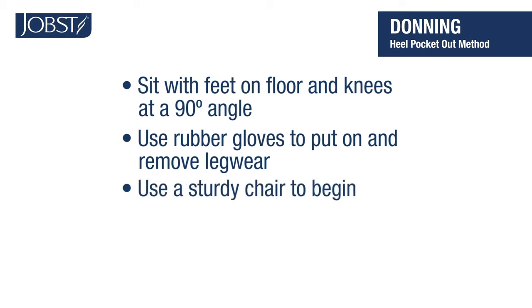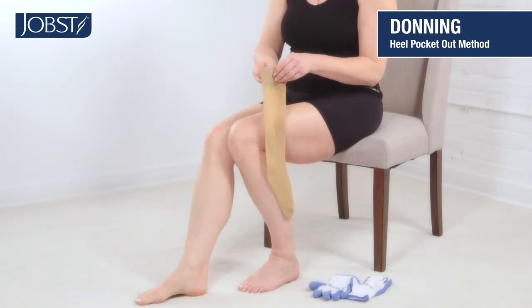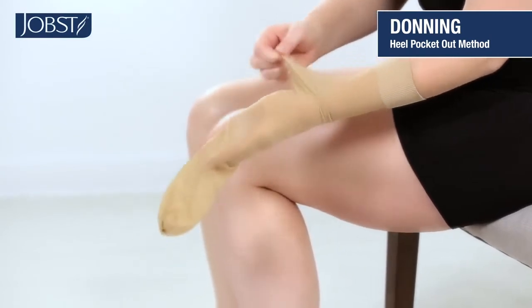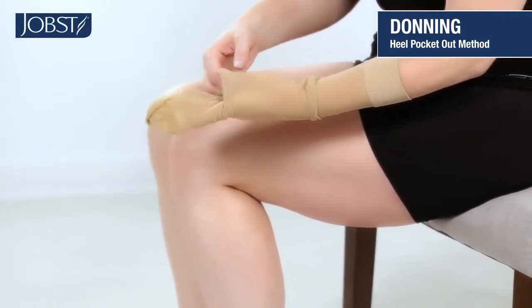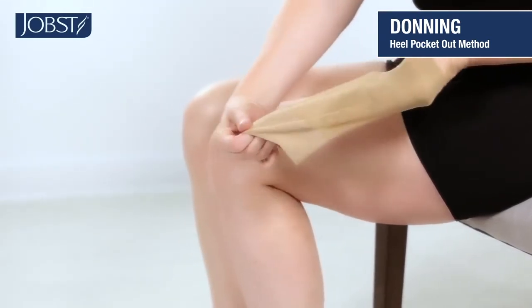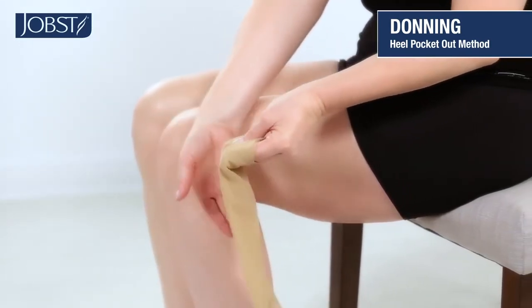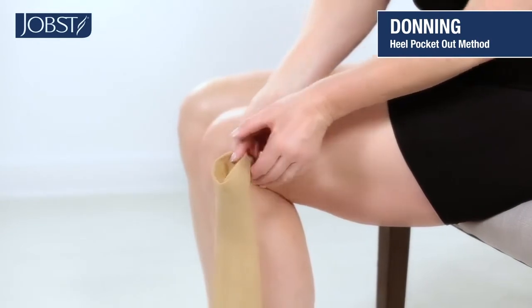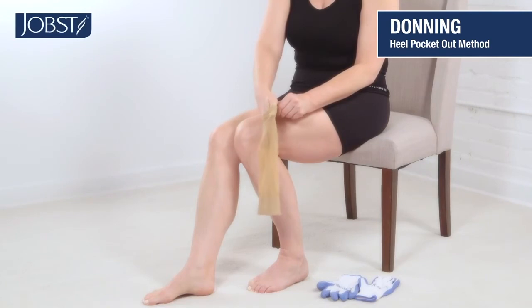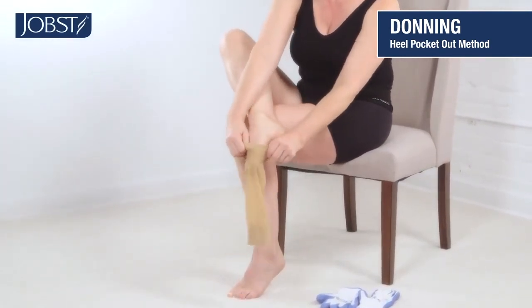Find a sturdy chair and let's get started. Now reach inside the stocking to pinch the heel. While holding onto the heel, turn the fabric of the stocking inside out. Open the stocking and slide your foot in until your toe and heel are in place at the foot.